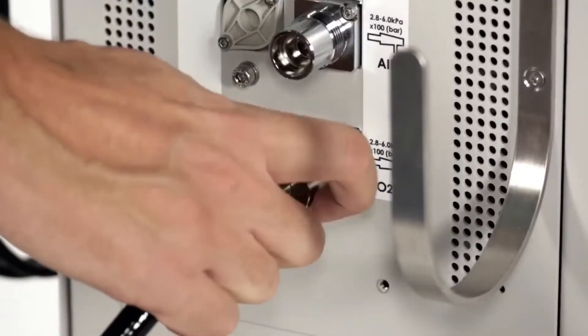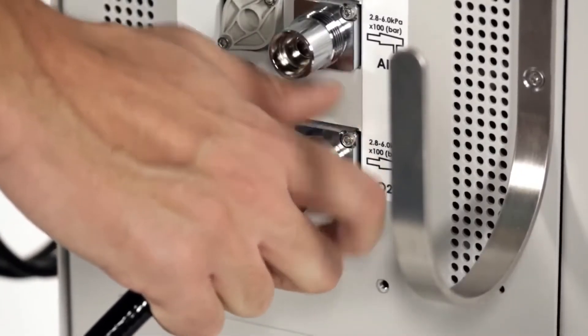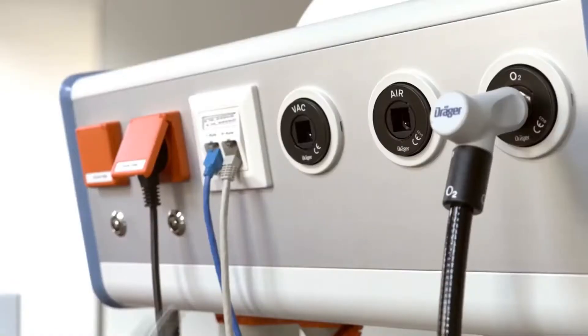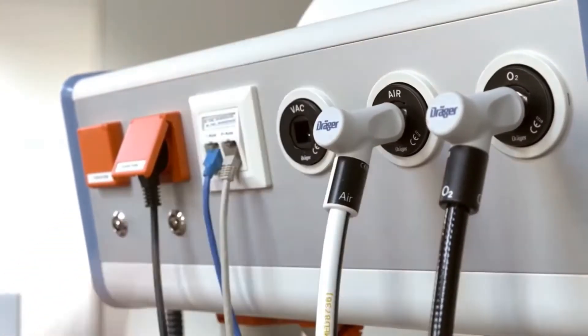Connect the pipeline hoses for oxygen, nitrous oxide and medical air to the outlets on the rear side of the machine. Plug the hoses into the relevant outlets in the wall.